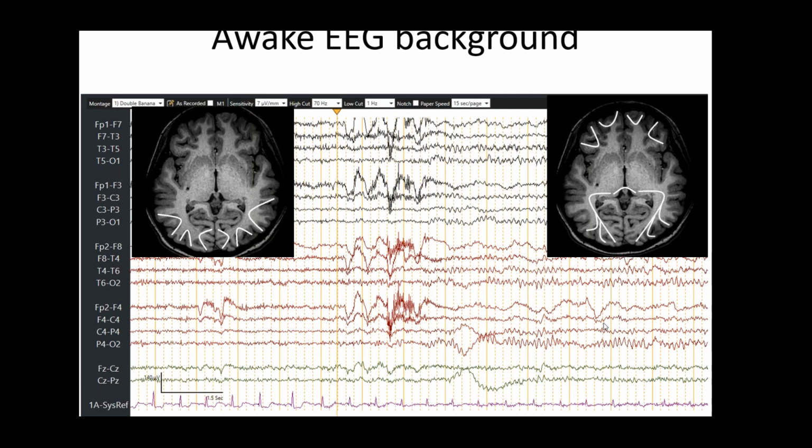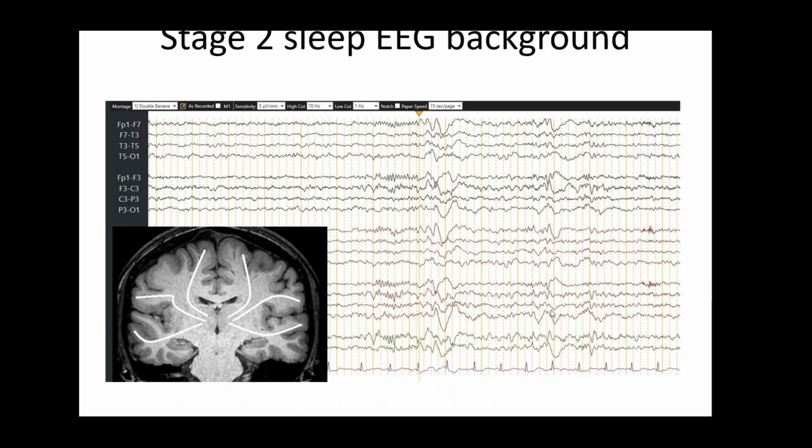All right. So based on whether the patient is awake, or asleep, or has the eyes open, or is relaxing, or is stressed out, it's going to change the activation of local networks versus large thalamocortical networks, and that's what the EEG is going to show you. So you could really tell when a patient is awake or asleep with the EEG.